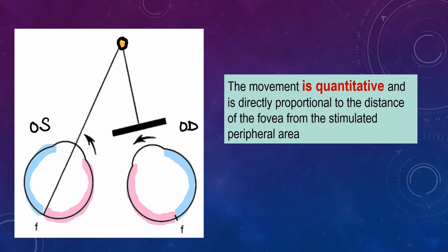This movement which the deviated eye makes is called a redressal movement. In this case, the left eye actually moved outwards in order to take fixation. Outward means that it is moving towards the left side, or moving temporally, in order to bring that image back onto the fovea. This movement is called the redressal movement.